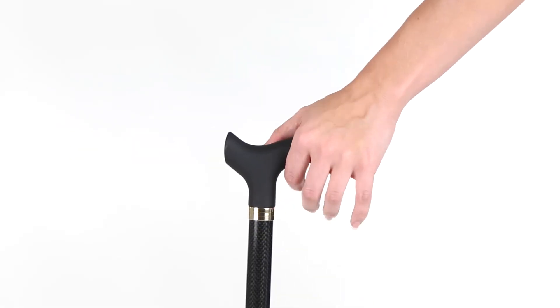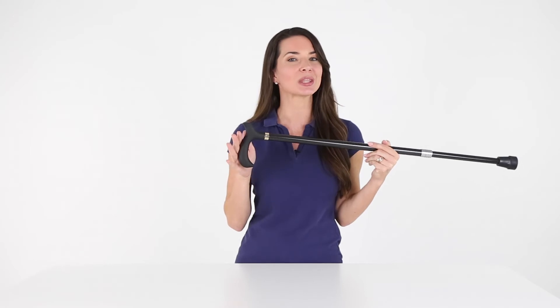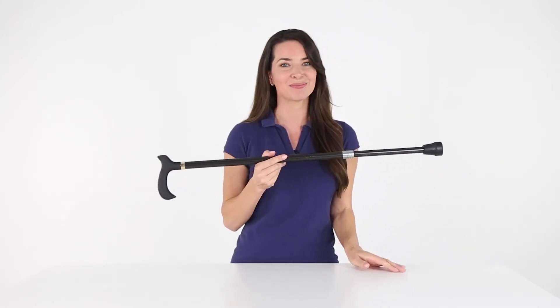The contoured derby style handle reduces hand and wrist fatigue, providing you with a comfortable and secure grip. Walk with independence and let's live better.